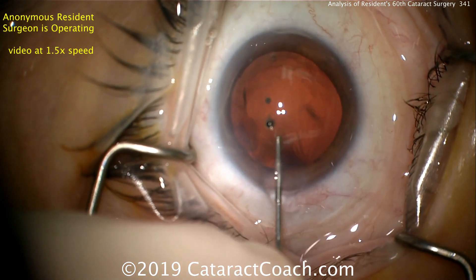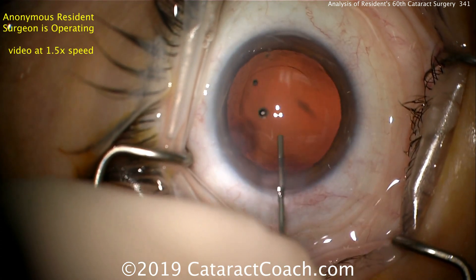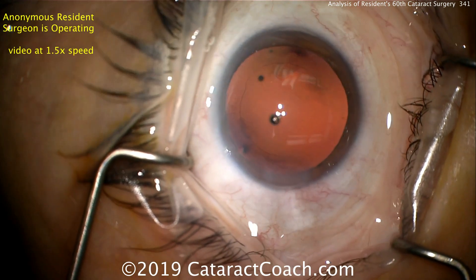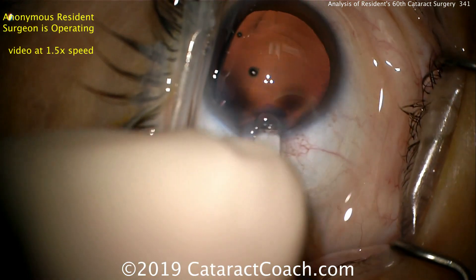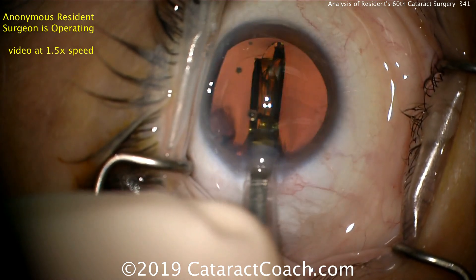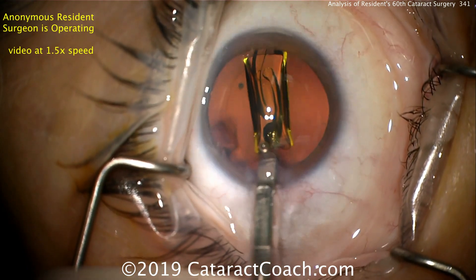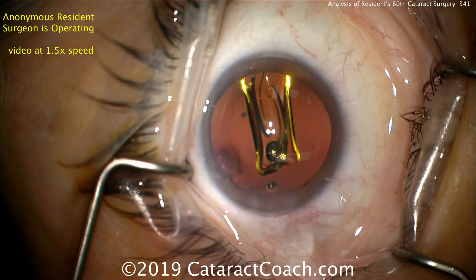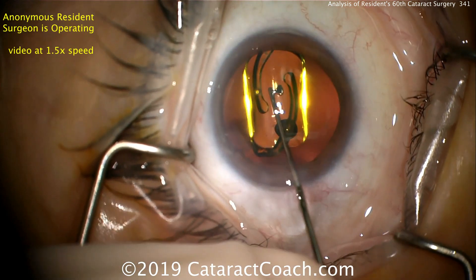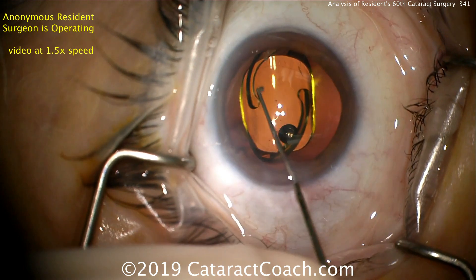Filling the capsular bag now with viscoelastic — looks like a cohesive viscoelastic. You can see that's a beautiful capsulorhexis — nicely done. That should overlap the optic just about perfectly, probably about 5 to 5.5 millimeters. Here comes the IOL with the injector going inside the eye — a nice, good delivery. It appears that someone else has loaded the lens because there's no break in the video, which is certainly appropriate once you've mastered loading the lens yourself — that task can be delegated to your scrub tech.